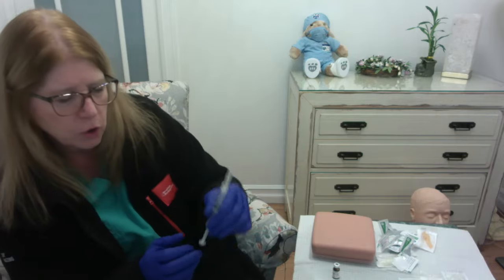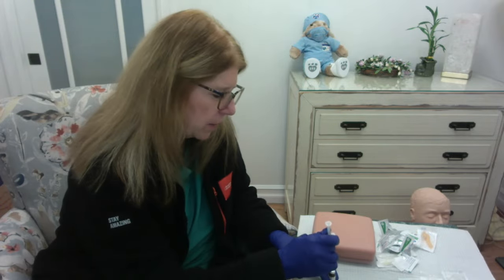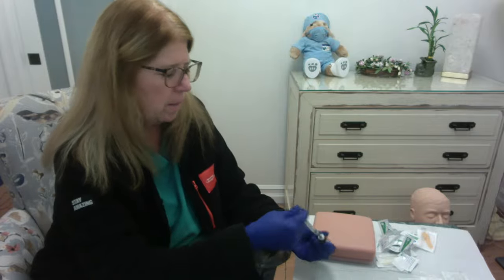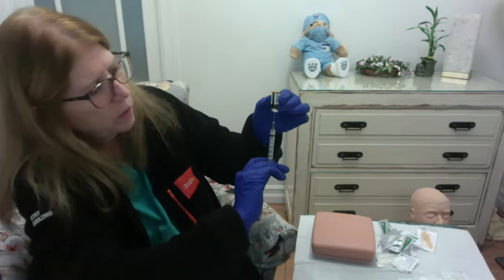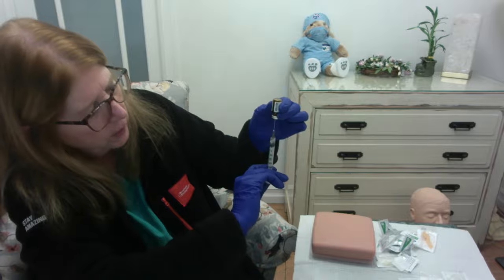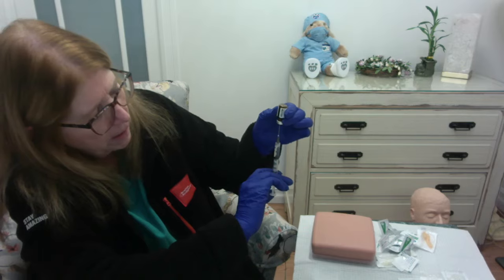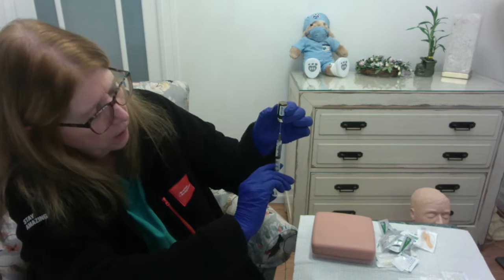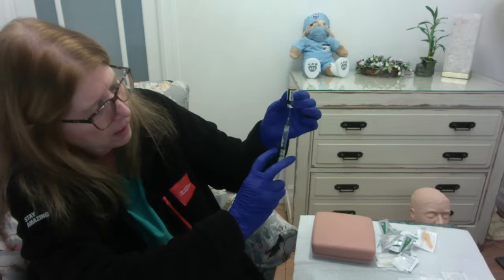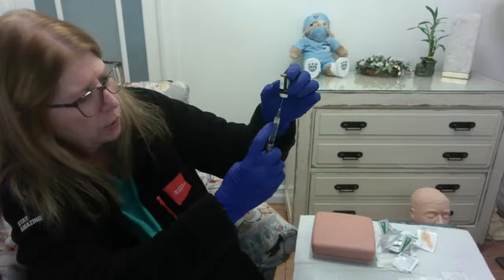So I draw back the 2 milliliters of air, take my cap off. I'm going to go right down the center of that bullseye with my needle. I'm going to inject the air. I'm going to invert, make sure that the window is facing me and the needle is below the level of the fluid. I'm going to let that plunger sort of come back on its own, and it might not get to 2, but it's going to get about 1.5, right? So now I'm going to have to help it. I'm going to pull that down, and I'm going to look for some air. So I do have an air bubble down at the bottom. I also have one at the top.